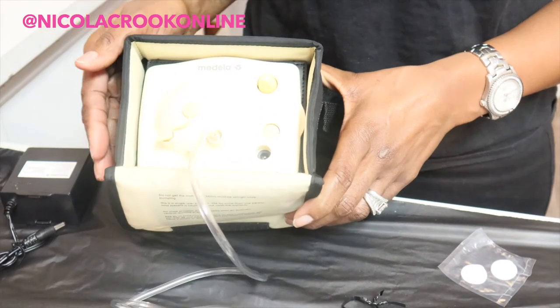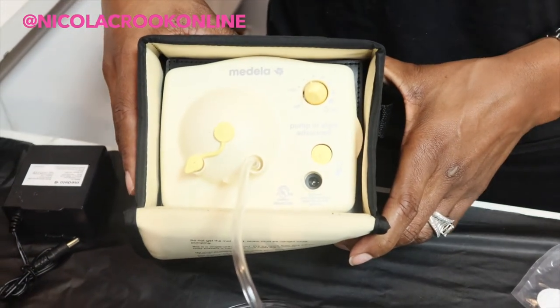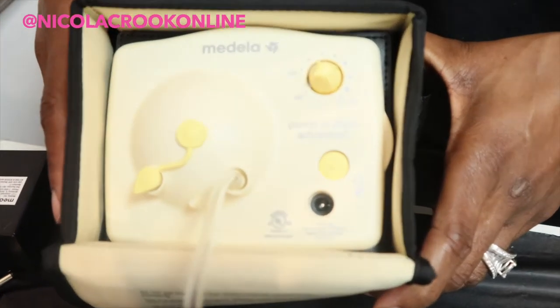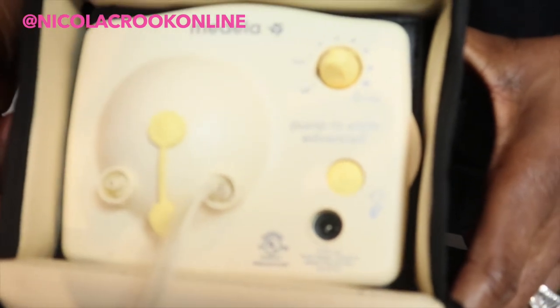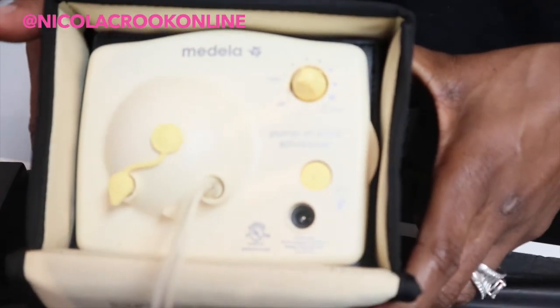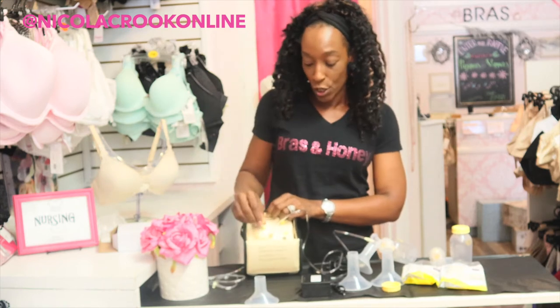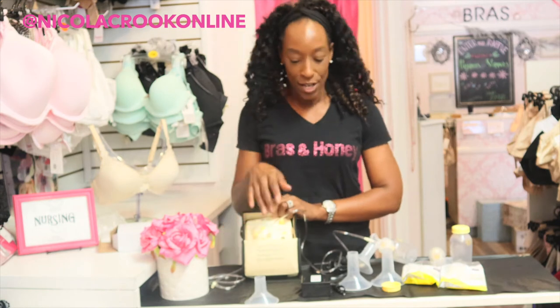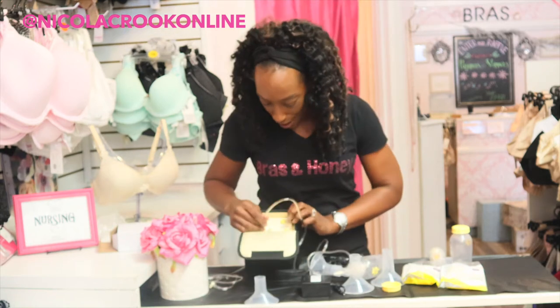Now I've connected everything to the pump but haven't plugged in the power yet. What's great about the Medela pumps is you can choose to dual pump — pumping both sides — or single pump, whichever suits you best. If you choose to dual pump, you just attach the other bottle to the other side with the other tubing. If you choose single-sided pumping, this little connector plugs into the other side, blocking it so the motor is only pumping from the one side and fills just that one bottle.